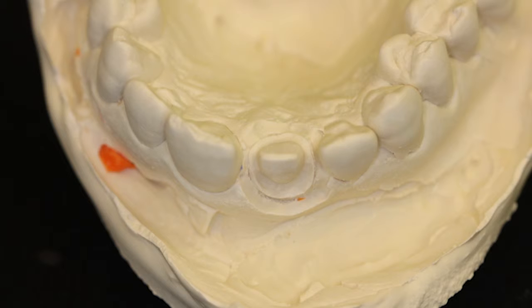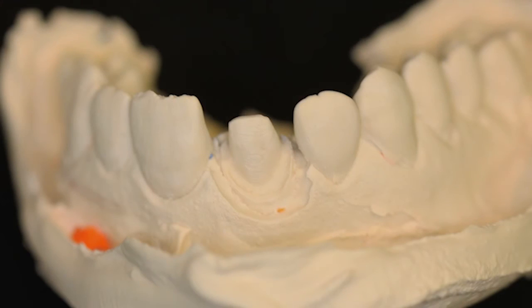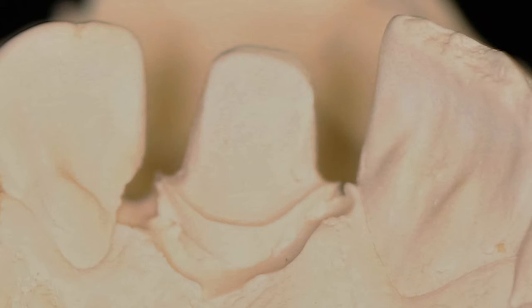After you pour it and separate it, this is what it looks like up close. Here's even closer — you can see the margins very, very clearly. We have put no blade, no burr, nothing in there. Everything's just perfect. We can look at this tooth from the facial side — you can see a very clear margin. And this is from the palatal side. You can see how clearly the margins are, and it really hasn't distorted anything.